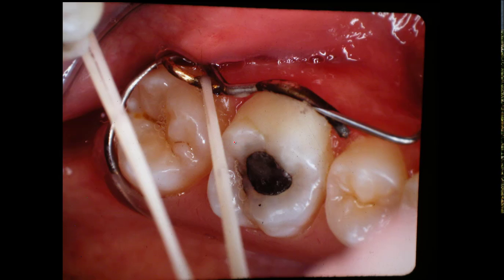Now here is the retainer, you see. This is a good composite. This is snapped over that. You hook the opposite side, it's over there too. And then you bring this one up, the wire will be set right here. You have to either press it and it'll span the wire and it'll snap over there and pop in under that. And you can pull on this class 3 elastic all you want to, and it will not pull that out.